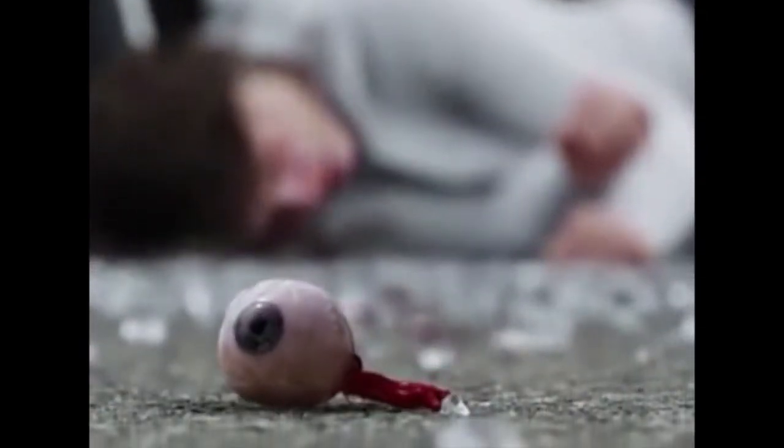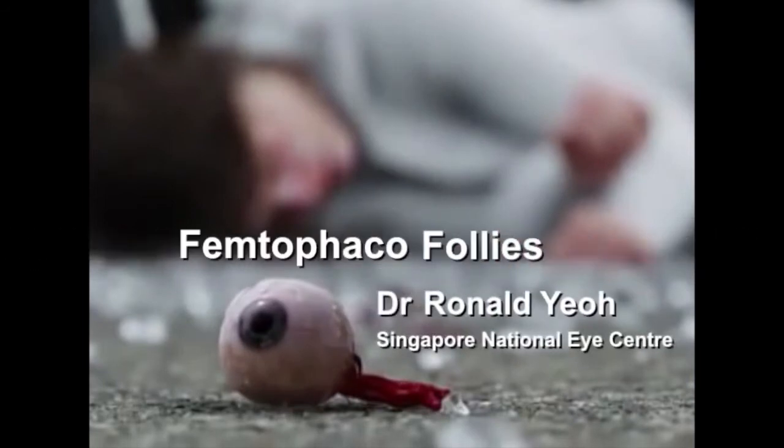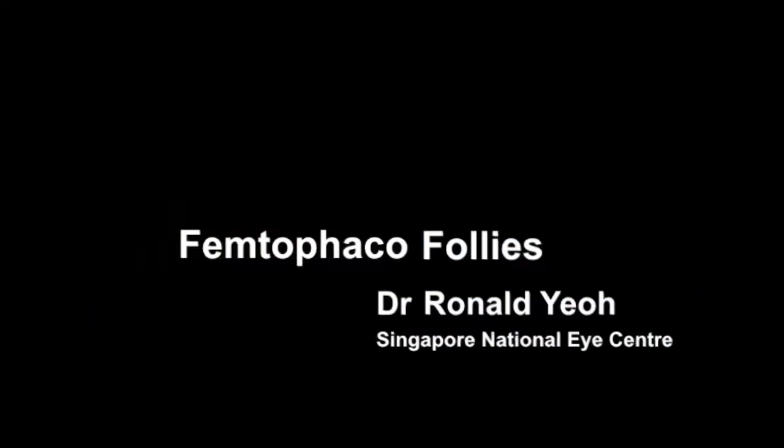Welcome to Femtophaco Follies. Femtosecond laser-assisted cataract surgery, or FLACS, is gaining momentum, but new operation, new complications. Let's have a look at some challenges and complications facing the femtophaco surgeon after the femto step.